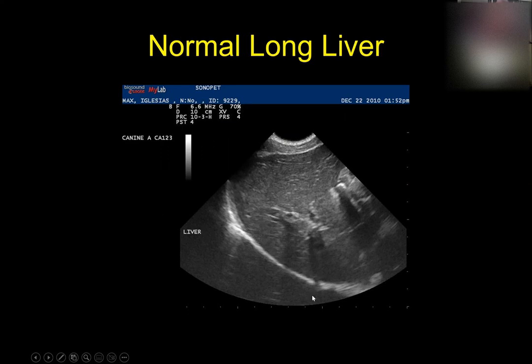Okay, when we ultrasound, remember, let me back up. When we talked about radiographs, we mentioned this one thing called hanging protocol. Remember that? That basically is a term that refers to back in the old days when you would hold an x-ray in your hand and you would hang it up on a view box.